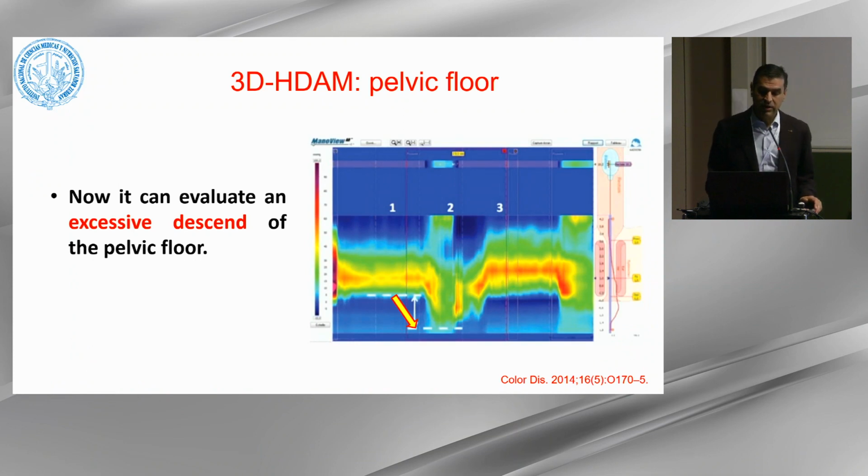This 3D also gives us an opportunity to assess the pelvic floor. With a pushing effort, we can see that the lower margin of the anal canal, the anal pressure, goes down during the pushing effort. With this, we can now measure the displacement that this lower margin has.